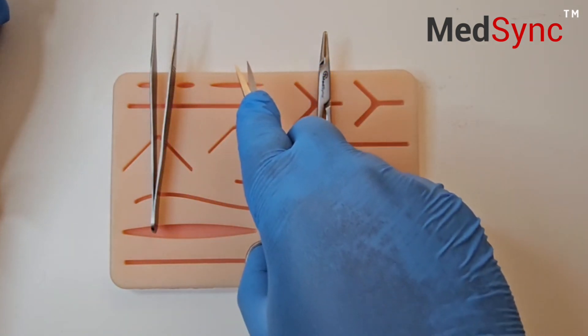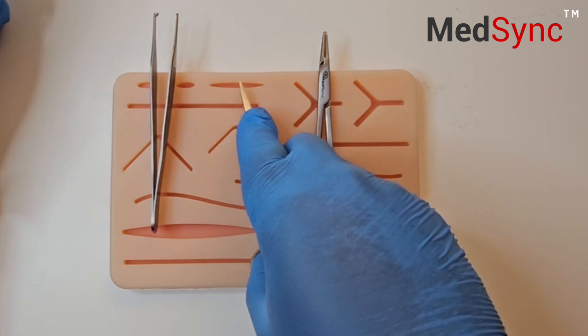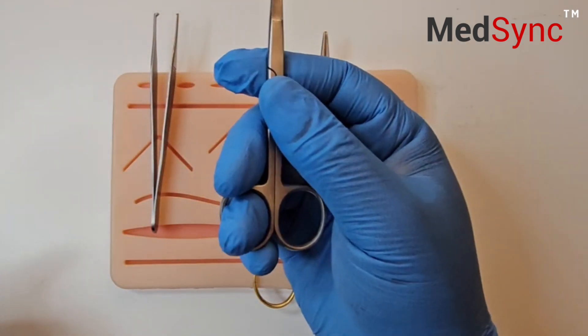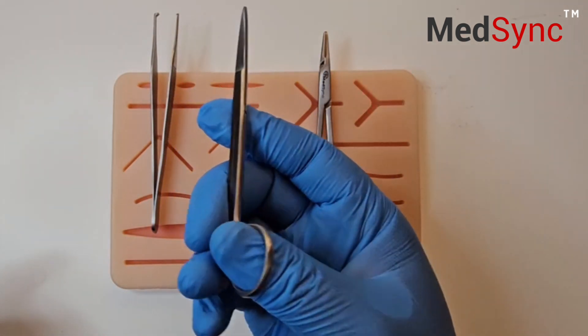Open the scissor, slide down the suture and cut with the tips. These are typically right-handed instruments so this is how you would hold it.